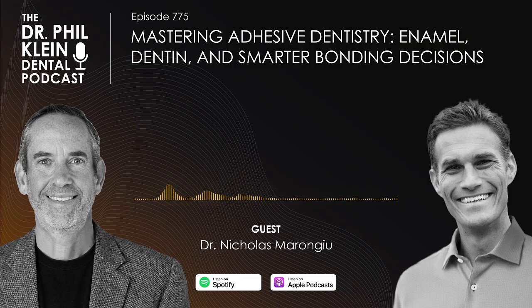So if I was really looking to reduce inventory, and I just went with this selective etch technique, I guess I would be pretty safe, right? Because I'm covering my enamel, and I'm also covering my dentin, and I've got everything in one bottle. I mean, it's actually 2 bottles. I have to use the phosphoric acid on the enamel briefly before I use the universal. But essentially, it's 1 bottle with everything in it that goes over the enamel and dentin after you do that selective etch. Is that a pretty safe way to go? Absolutely. As long as you're respecting the dentinal surface with your protocol and your process, that selective etch technique with the universal adhesive is outstanding. Right. And minimal sensitivity, it's been wonderful.